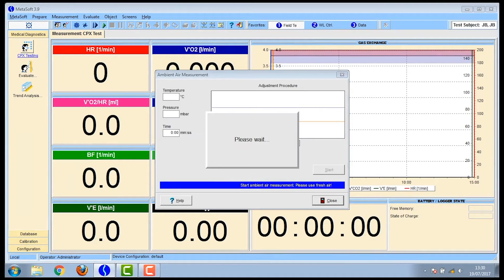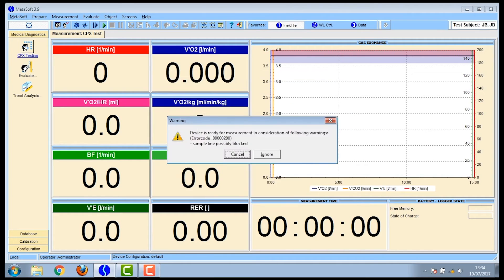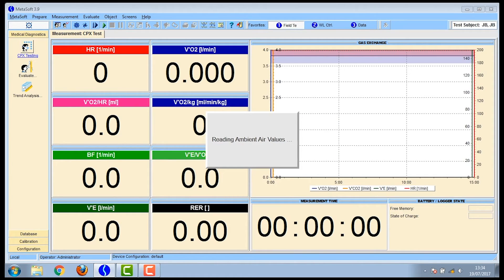Go to the software on the computer and click start — the green triangle on the top line on the screen. Before starting the test, you have to take an ambient gas sample for calibration. Take the sample line out of the flow sensor and leave it in the air so the air calibration occurs. You've got to wait for the straight lines to go across the screen before it accepts it. Once it's ready, put the sample line back into the flow sensor and the recordings start occurring — the data starts being collected and is automatically saved to the participant you've selected.